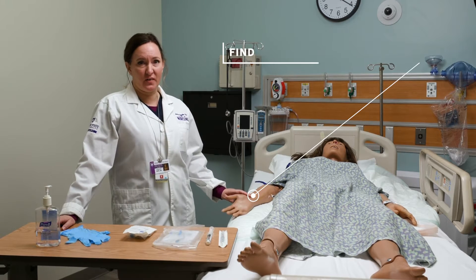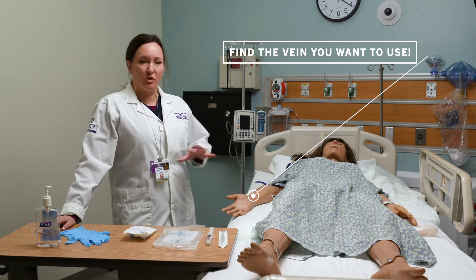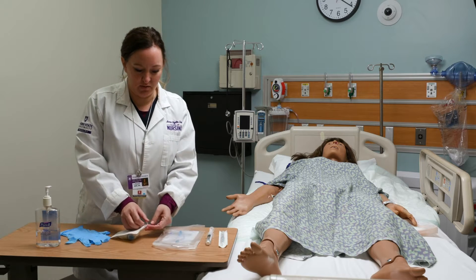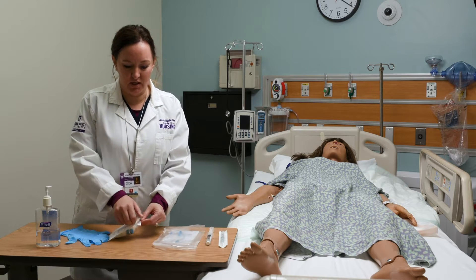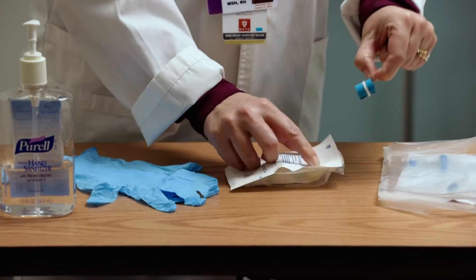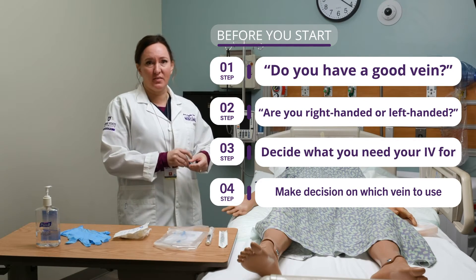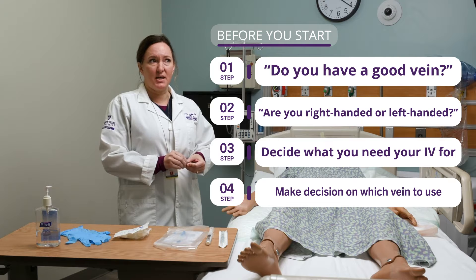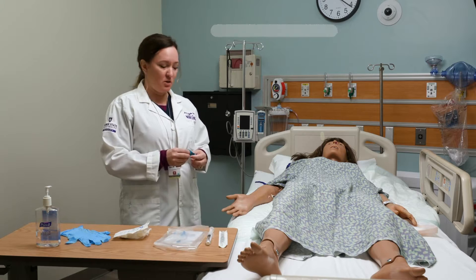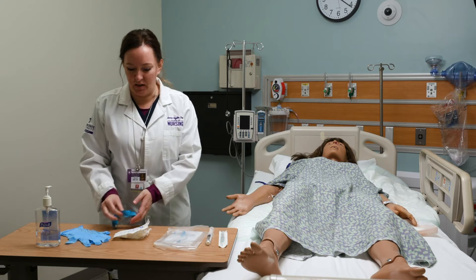I think it's a good idea to try to find the vein that you want to use when you first come into the room, because then you know which side of the bed to set your supplies up on. So I like to just get out my tourniquet, open my package, and carefully get the tourniquet out without touching anything else. Ask the patient if they have a good vein, if they're right-handed or left-handed. Decide what you need your IV for and make your decision on which vein you want to use. We'll say that I already did that and I found the vein on the right arm, so I'm ready to go.